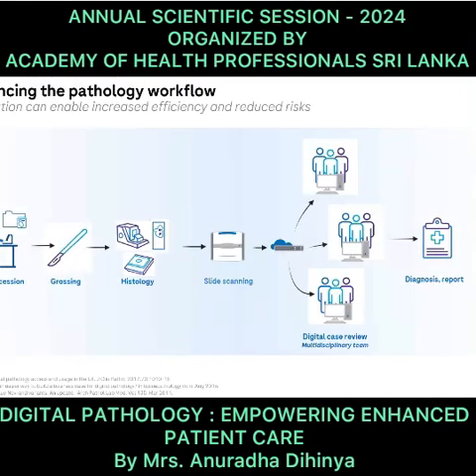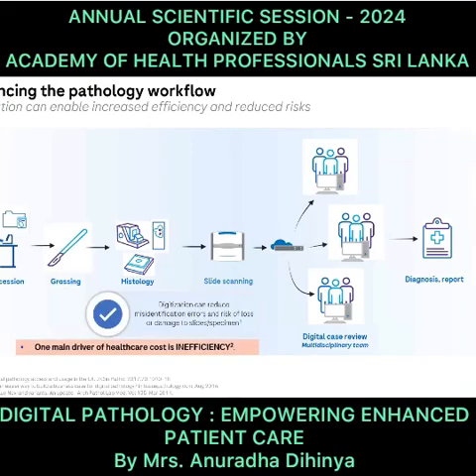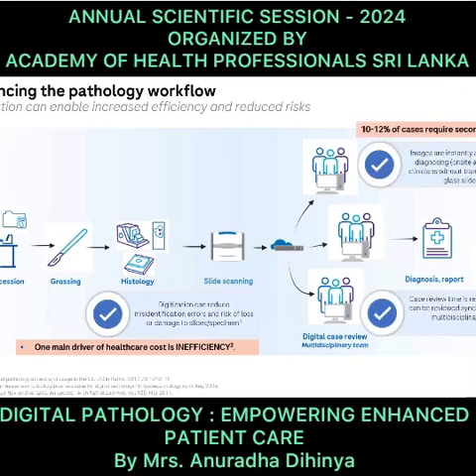Now coming to what is advancing in the pathology work area, and what the benefit is when we go into complete digitalization in the workflow as well as in the digital scanner area. The main driver here is healthcare cost inefficiency.